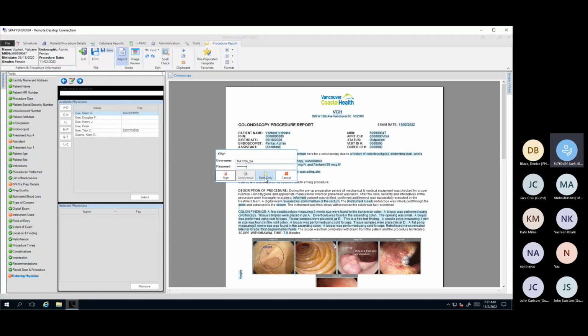So just to clarify, your login here is your network login. And on the handout that I sent via the invite, you'll also know that we have tap and go enabled all over the hospital now. You may have to use EndoPRO from the Launchpad bar at the top of the monitor and tap in with your ID in order for it to log into EndoPRO as you. Otherwise, it may pick up the generic login that's enabled on most of the PCs. But your logon here is, in fact, your network ID.